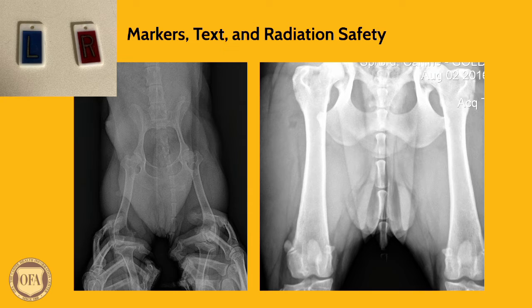Appropriate ALARA practices should also be followed at all times. This includes appropriate shielding of personnel, limiting number of retake images, and keeping human anatomy out of the primary beam.